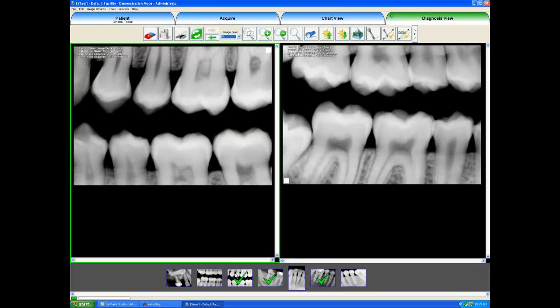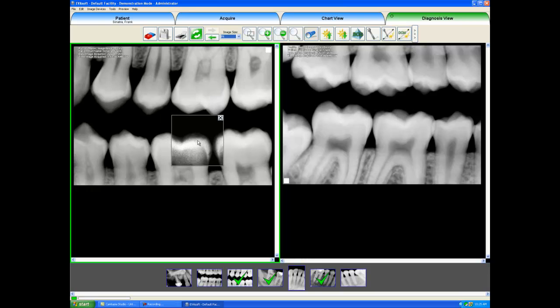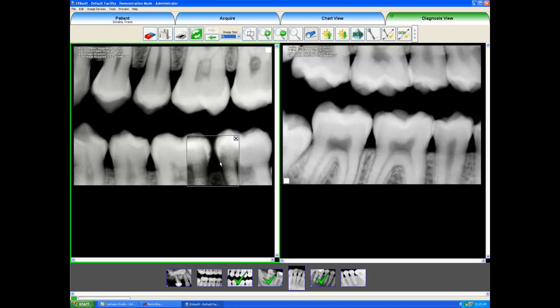I will click on this bitewing down here, and it's hard to see because it's an incipient case of class 2 decay, but we can see a little wedge right here for interproximal decay — it's not even through the enamel yet. I will click back on the caries spotlight, and as I bring that over the image, we can see the wedge, the darker shade of gray, shows up much more clearly, thus indicating that we have some caries.